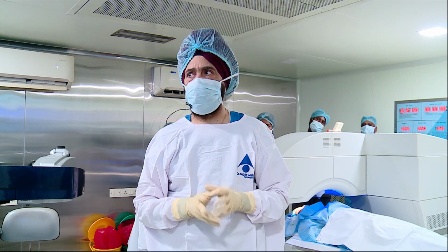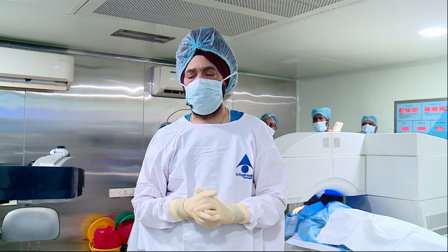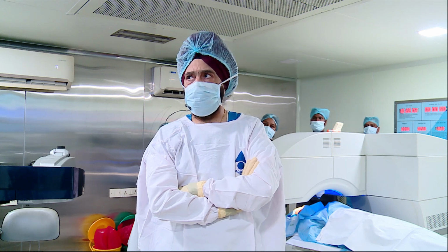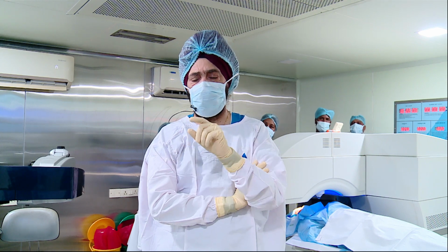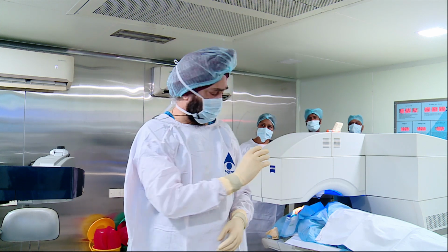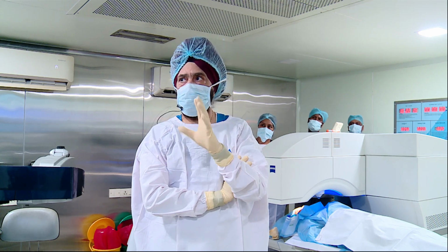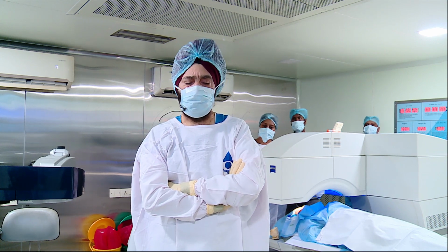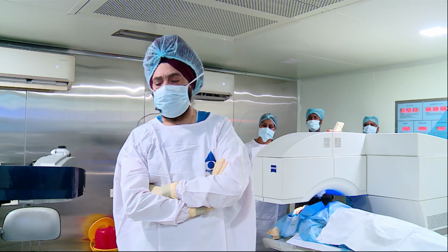So there are two things which are important. You can't even change the centration in the Visumax 500, but the new machine allows you to center also, as it allows you to do the cyclotorsion compensation. But as things stand today, if I am not centered, then I will release the suction and redock. And for the cyclotorsion, the mark is there, the ink mark through the infrared ink, and you can rotate the patient interface to get cyclotorsion compensation. I am getting excellent results with this cyclotorsion compensation on the mark that you do for the patients. But obviously an automatic registration of the iris with cyclotorsion compensation would be something that is always desirable.